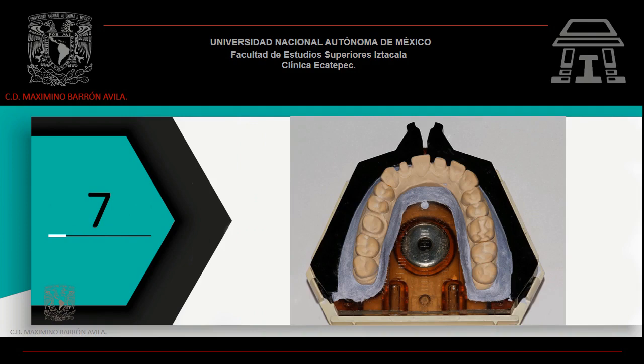Prepara yeso tipo 3. Colócalo en el sistema ACUTRAC. Centra tu modelo de trabajo procurando no atrapar burbujas. Presiónalo hacia abajo, retira los excesos de yeso y permite que el yeso termine su proceso de fraguado.